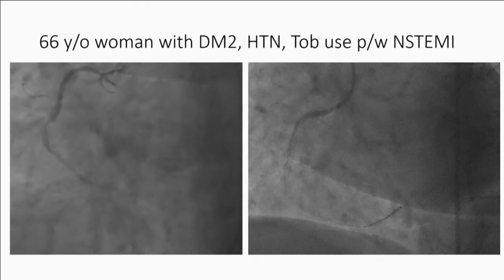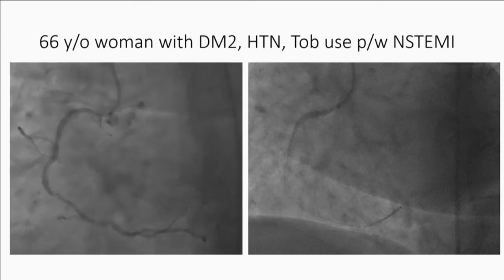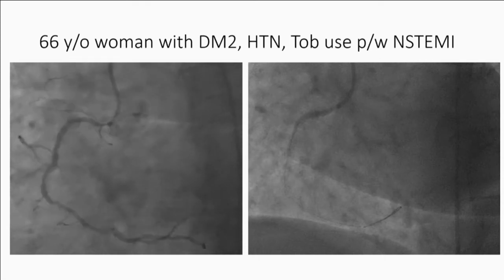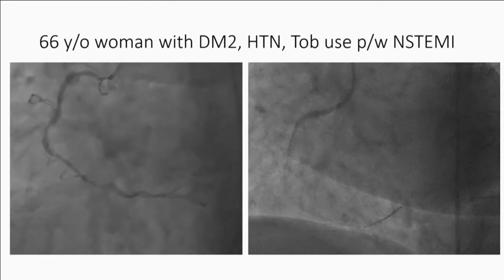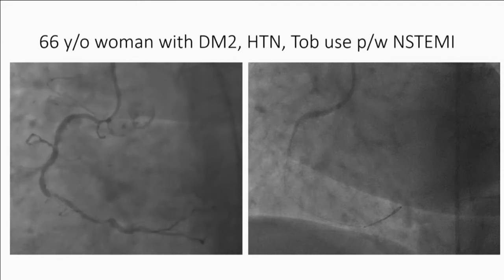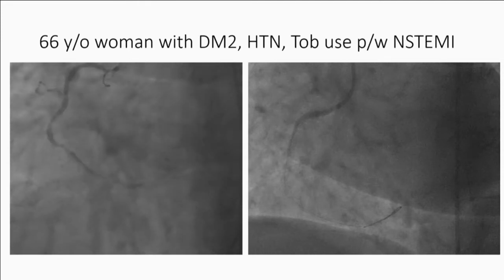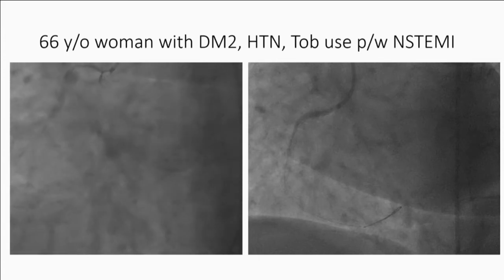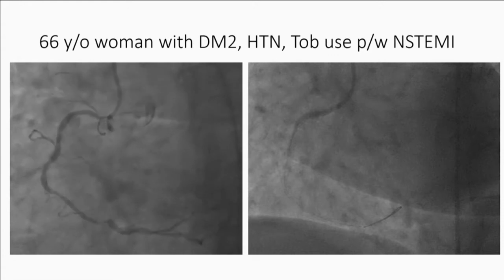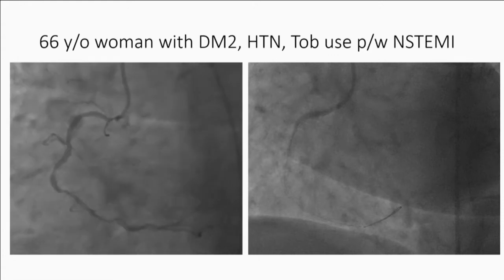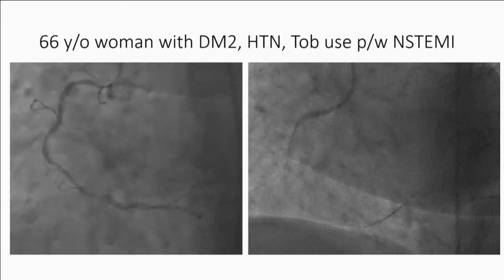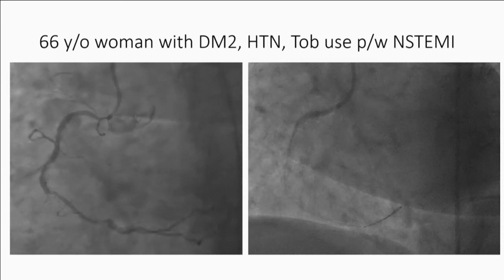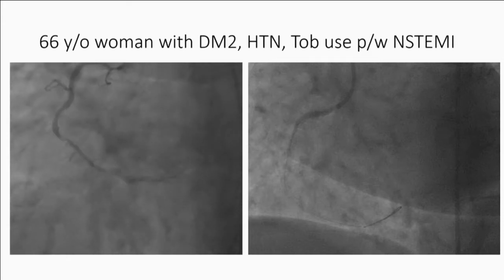A sixty-six-year-old woman who presents with multiple atherosclerotic risk factors and non-STEMI. You can see on the diagnostic angiography in the right corner, on the left she has severe calcified disease involving the ostium, the mid-vessel, throughout the distal vessel. We predilated this and felt there was good expansion of the predilation balloons to implant stents. Stents were implanted throughout the vessel. There was a resistant lesion in the mid-segment that required high-pressure non-compliant balloon dilation.